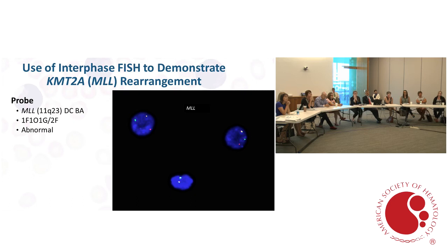Do you know the sex of this particular individual? What's the sex? Female. There are 2 X chromosomes. That's written next. Commas are usually going to define all these different abnormalities. So every time you see something like DER, which stands for derivative, think unbalanced.